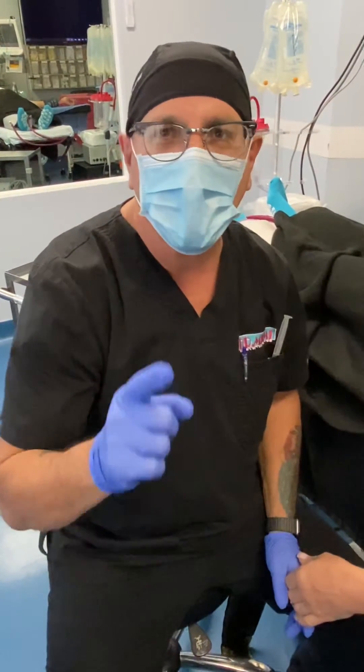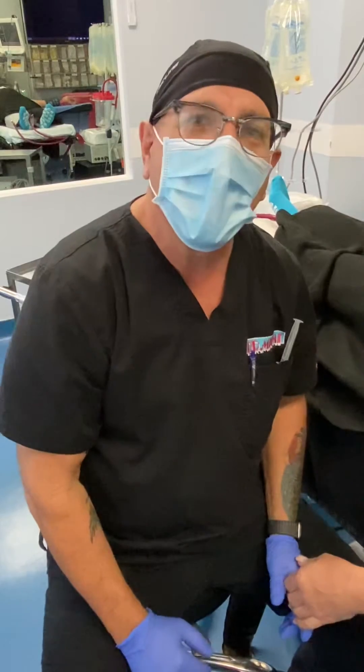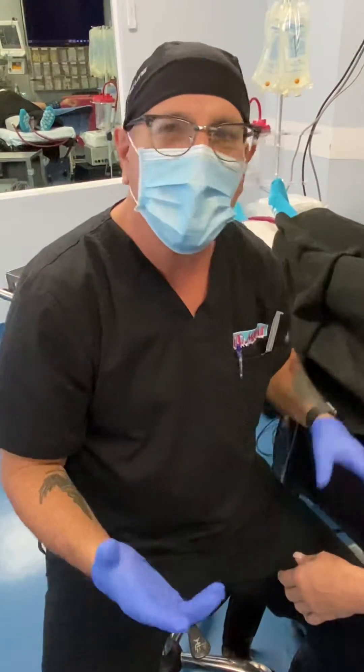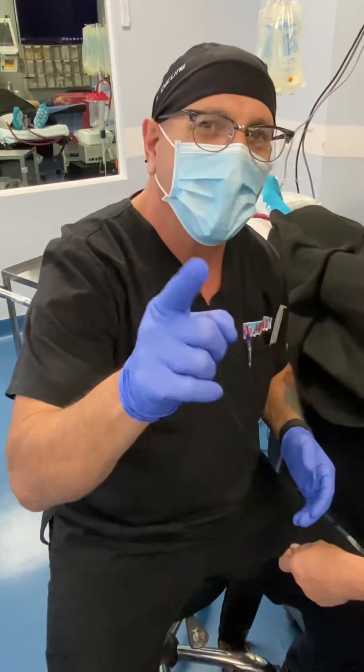Good morning, it's me Barry Miller from Dr. Miami's office. A lot of people have been reaching out asking, hey Bear, how come you haven't done any IV insertions in a long time? Your lucky day — I got a good one for you.